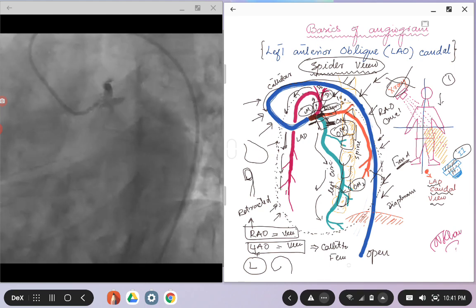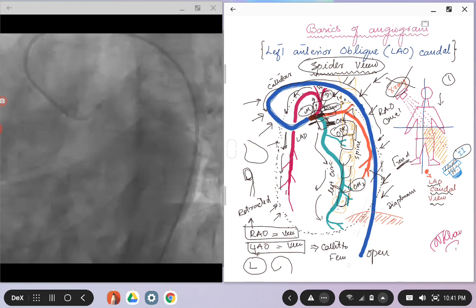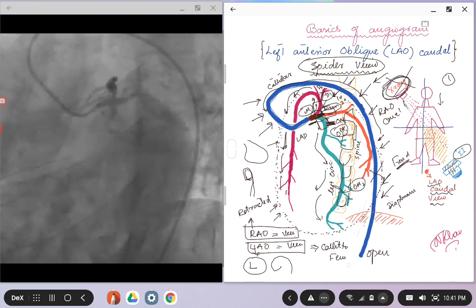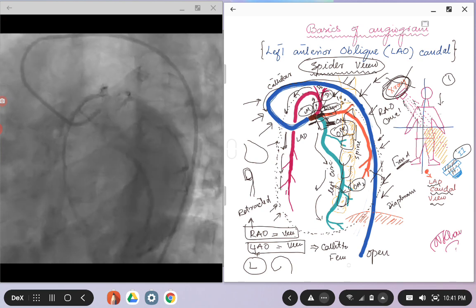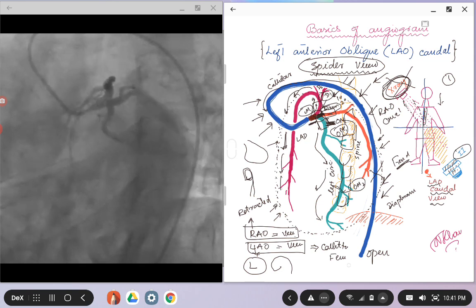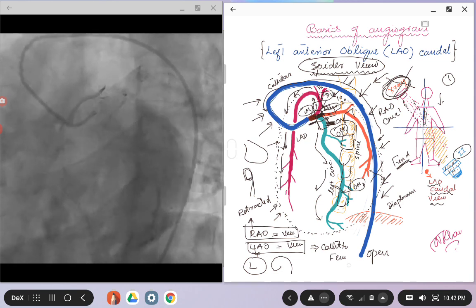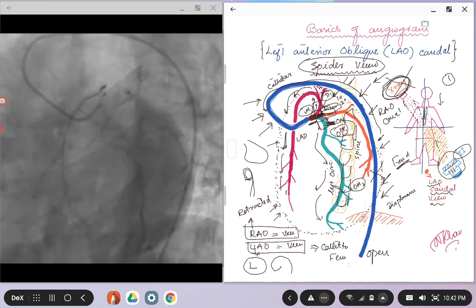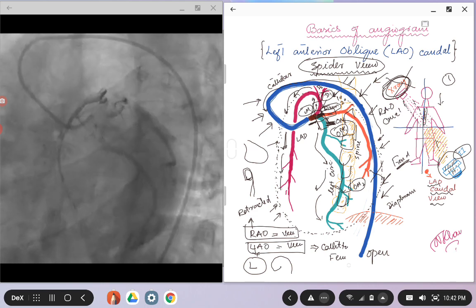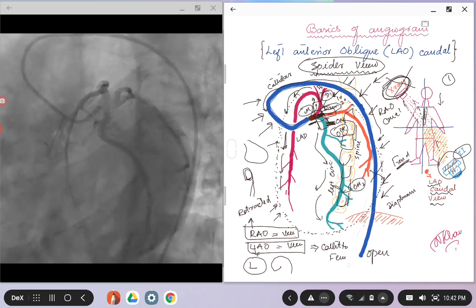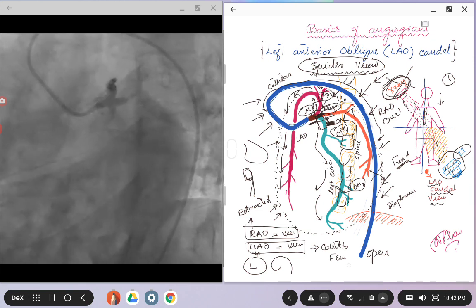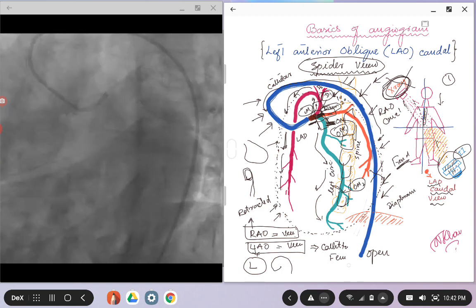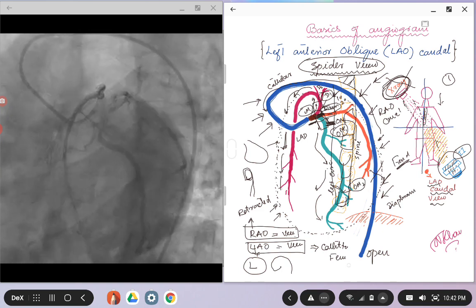So now going back, as we talked about, in the LAO caudal view the x-ray source is coming from the right, so it's coming from the right and going down. And here is the spine of the patient, and then the image intensifier picks up these x-ray radiations, and then you see an image. So basically, if you get this picture in your mind, you will see that in the cine image you see the spine to be on the right side.